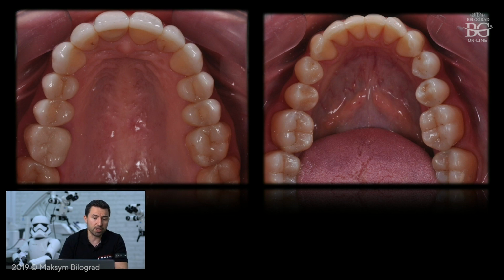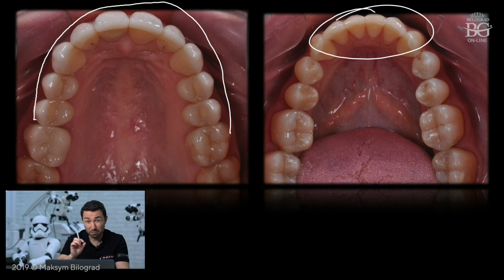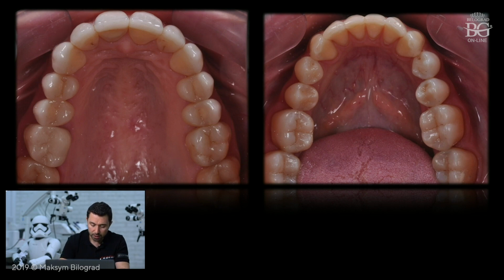And you can see a combination with ceramic veneers. Ceramic veneers we used for the upper arch from 5 to 5. These teeth were restored with porcelain veneers. The rest of them were restored with a copy-paste technique utilizing composite materials. And lower teeth were restored with a little bit of added composite increments, and we made bleaching here.